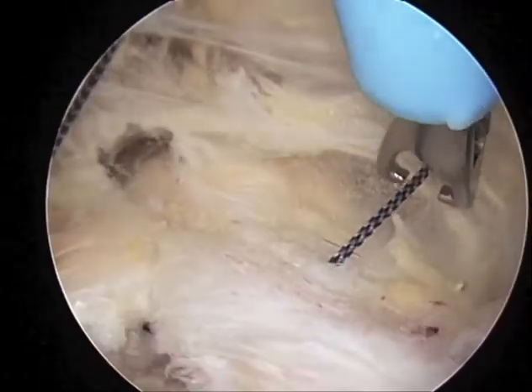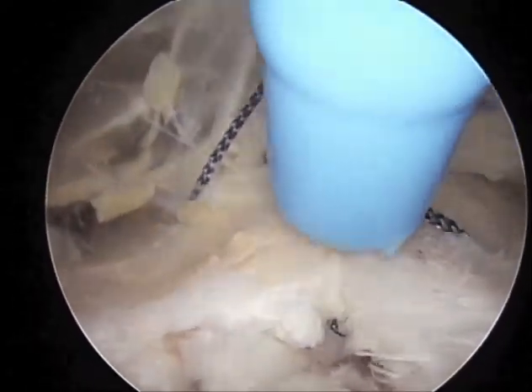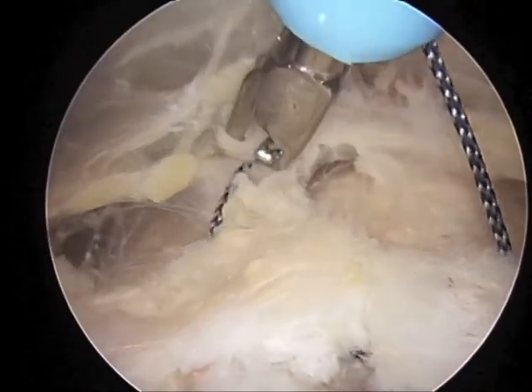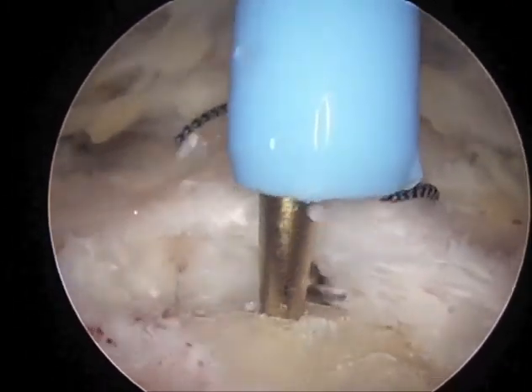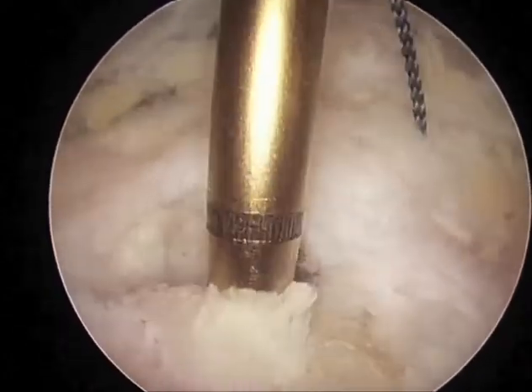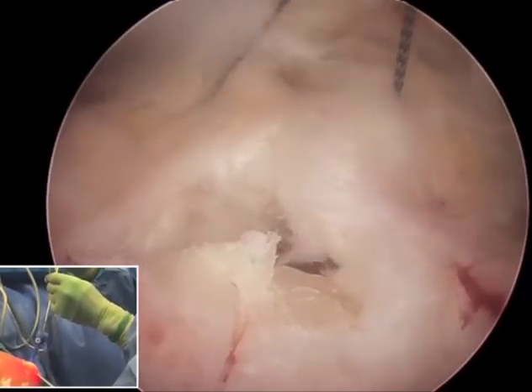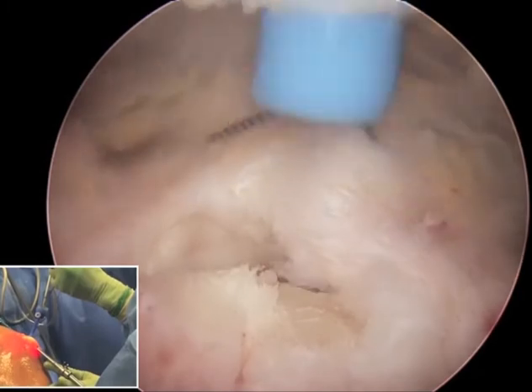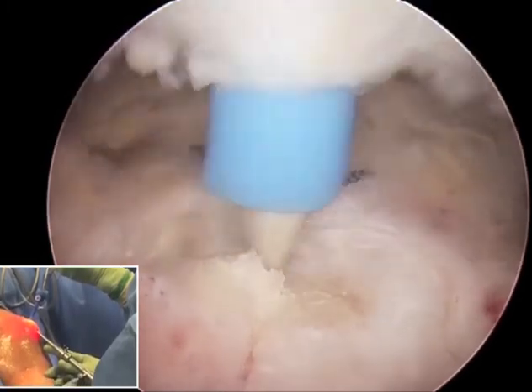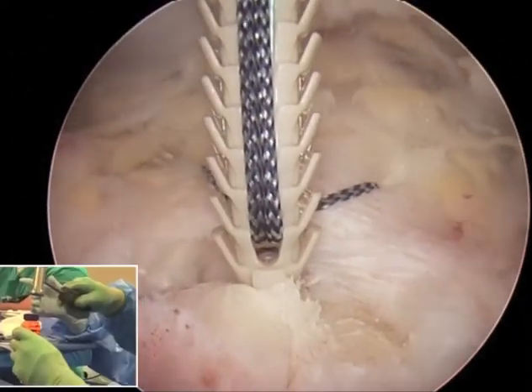At this point we pick our spot to do our repair, so we retrieve both sutures out through our cannula. Then, using a knotless fixation device, we create a tunnel into the tip of the olecranon. This bone is very hard and requires over-tapping in order to facilitate placing an anchor. One should also be careful not to fracture and to make sure you're centered on the hole. The sutures are passed outside the elbow into the anchor, which is then brought through the cannula and tapped into the bone as seen here.